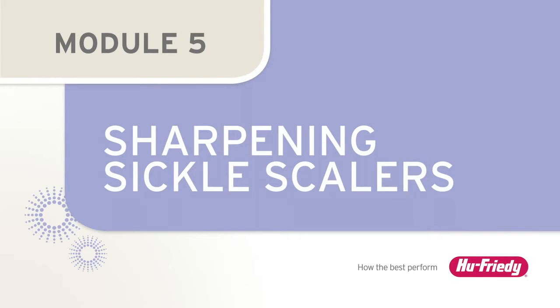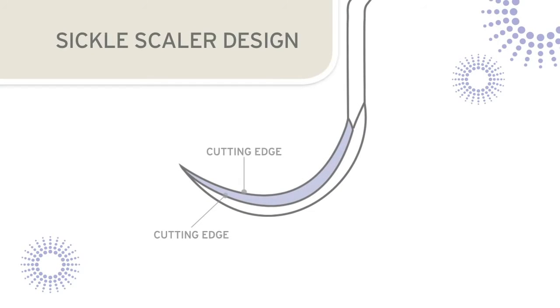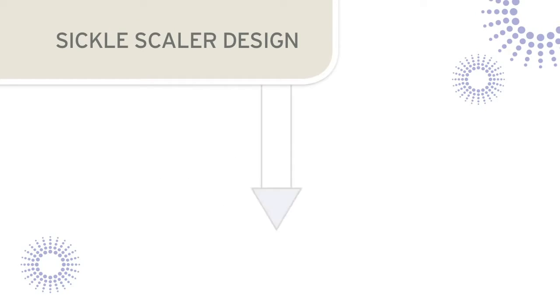Sharpening sickle scalers. Curved sickle scalers have two cutting edges. These cutting edges are formed by the junction of the facial surface of the blade with the two lateral surfaces. The two cutting edges converge at the end of the instrument to form a sharp, pointed tip. The sickle scaler has an almost pointed back, and the cross-section view reveals a triangular shape.